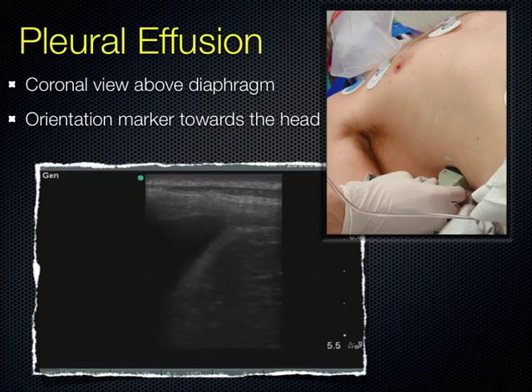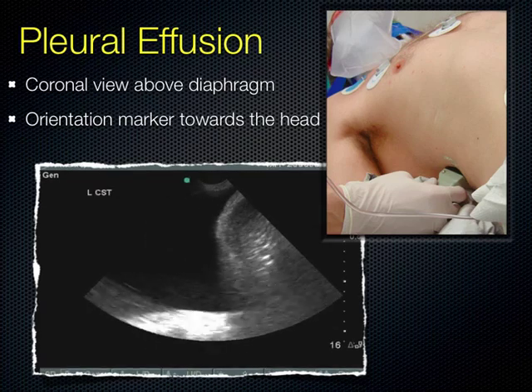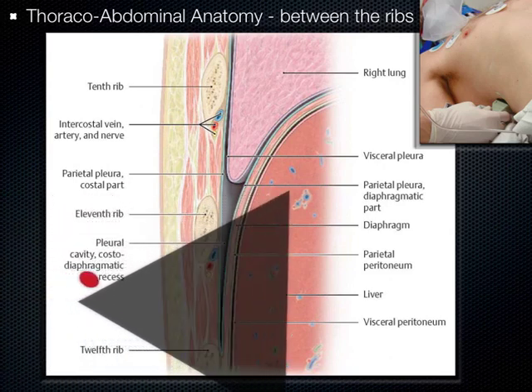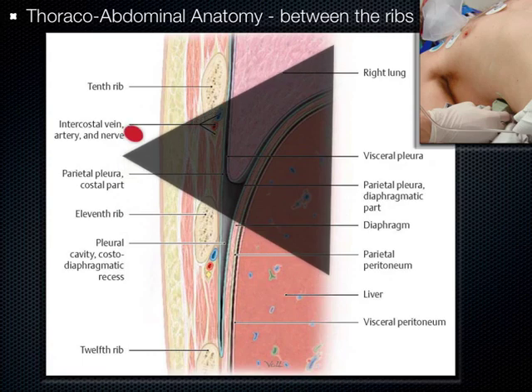This is the space, again, where you're placing your probe. You're finding the liver, you're moving up and down so you can find that person's diaphragm, and this area is where you want to image. People's diaphragms are in different places. People don't necessarily read the textbooks. COPDers have very low diaphragms because their lungs are hyperinflated. Some people have great big livers and their diaphragms are up in their armpits. So you need to look around and find out where their diaphragm is. Don't just assume.